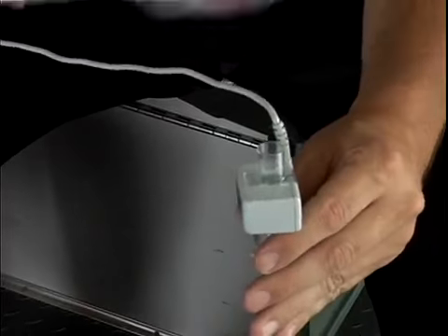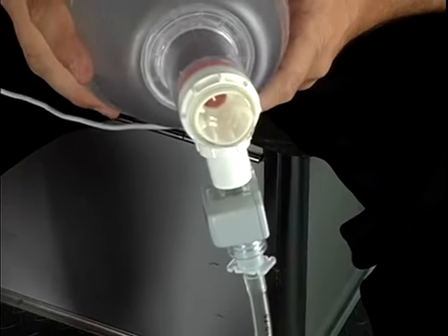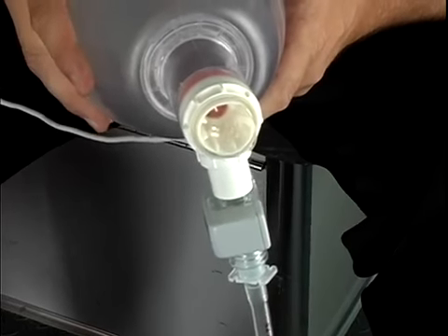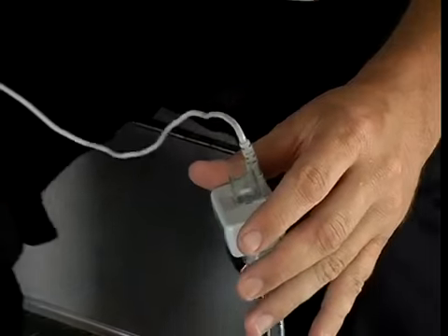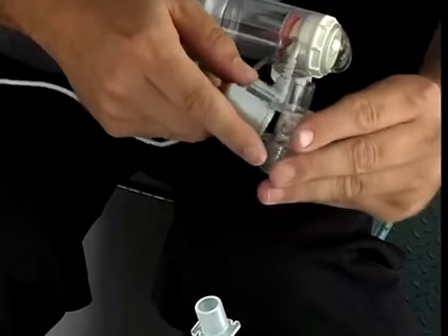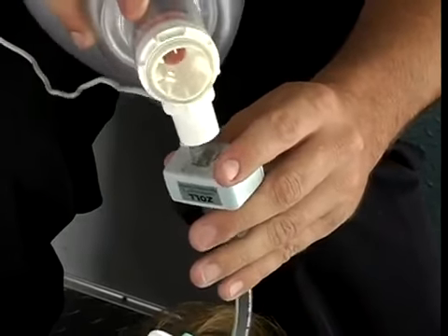As your patient exhales, their CO2-rich gas passes through the airway adapter where it is measured. As the mainstream sensor is not in direct contact with the patient, it cannot be contaminated by moisture or secretions. If the mainstream airway adapter becomes contaminated with secretions, water, or by an aerosolized medication, it can easily be removed and replaced.